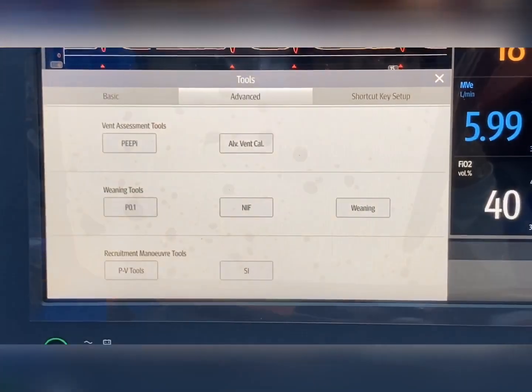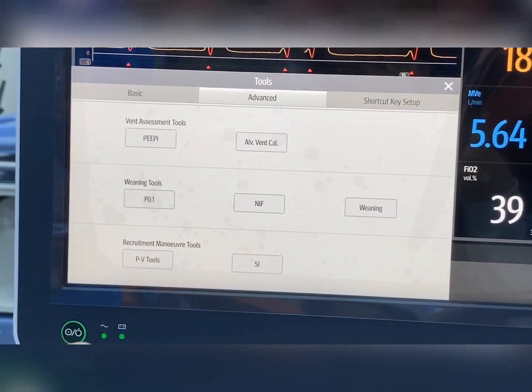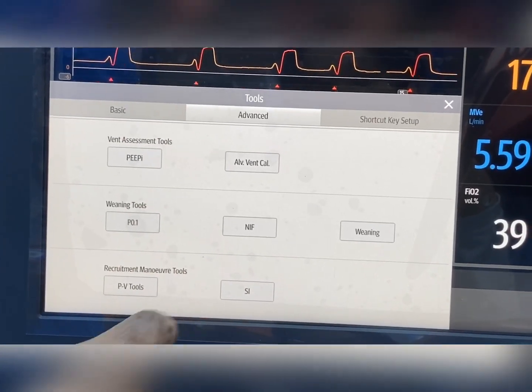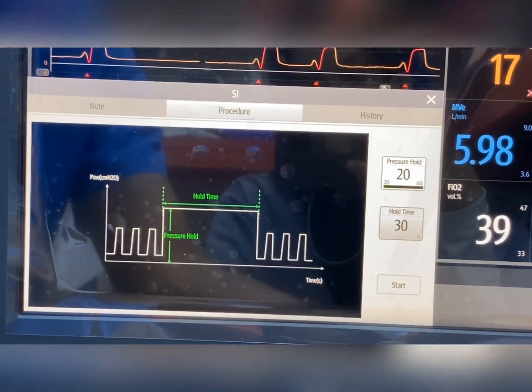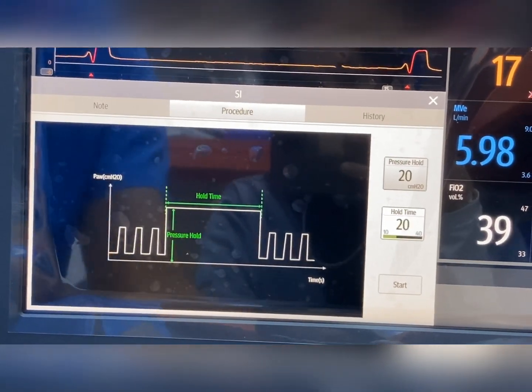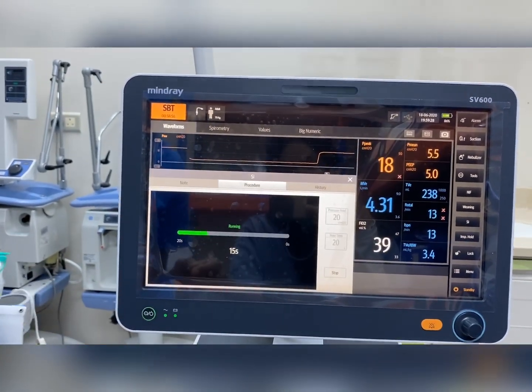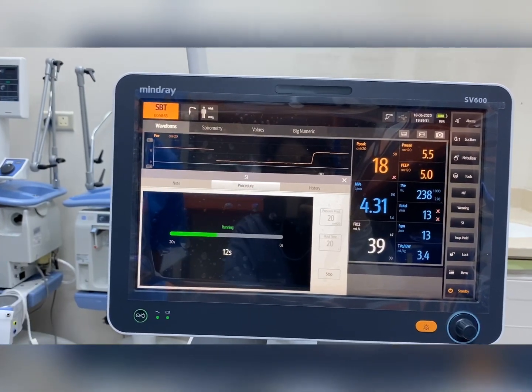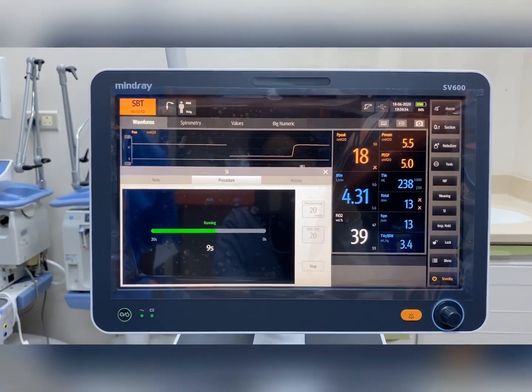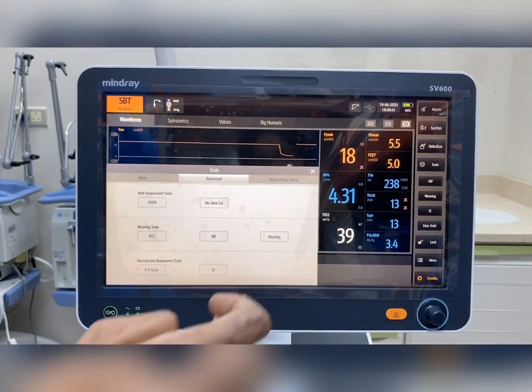The next option is recruitment maneuvers. Usually recruitment is done by manually manipulating ventilator settings, but this machine has a built-in option called SI — sustained inhalation. You can set exactly what pressure you need; for example, keeping 20 cmH2O pressure for 20 seconds. Once you press start, you can see on the graph that the pressure is continuously being delivered for 20 seconds.